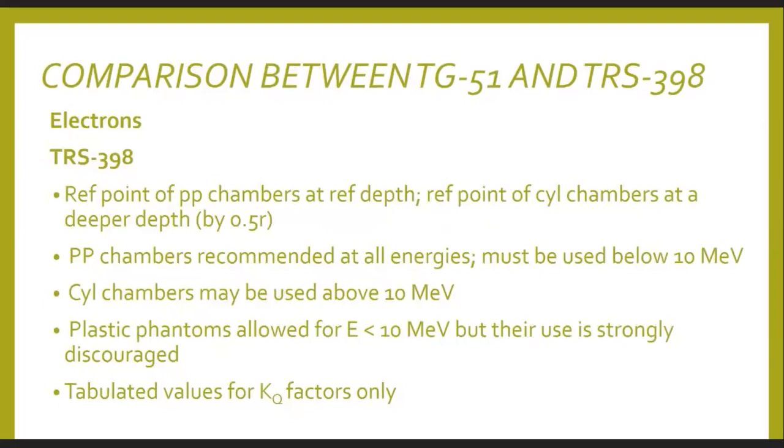Parallel plate chamber is recommended for all electron energies, but must be used below 10 MeV in that protocol. So the cylindrical chamber is not recommended at all below 10 MeV. It can only be used above 10 MeV. Plastic phantoms are allowed for electron energy below 10 MeV.